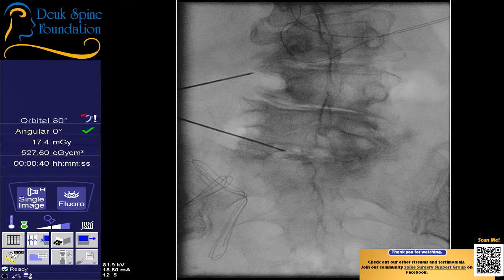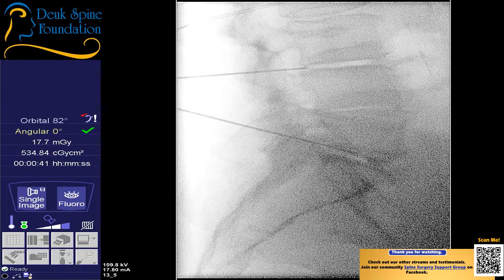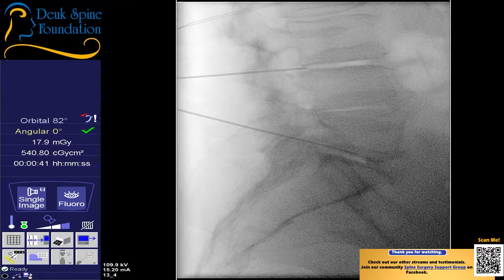Luis got excited. He thought we were ready. But that's why, folks, when you do this type of surgery, you have to use your fluoro for navigation, and you can't just rely on one view. You see the lateral view at 3-4 looks like the needle's in the perfect position in the back of the disc. But in reality, because of the curvature of the spine, that needle is far from being in the perfect position. And had we proceeded, it probably would not be good.